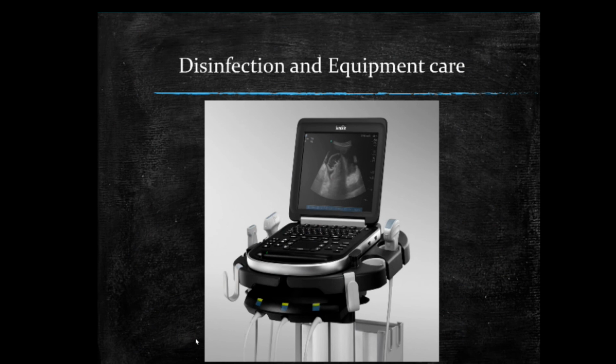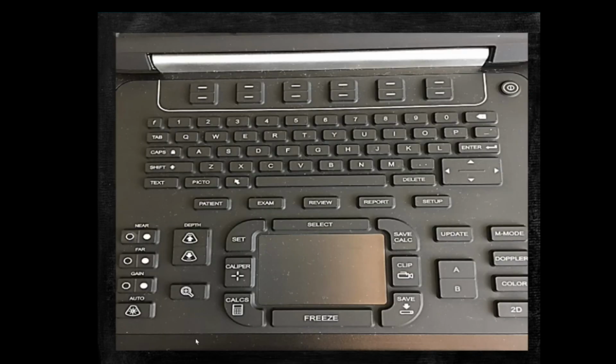Real quick note on disinfection and equipment care. Generally at OHSU, the preferred cleaning solution is the Oxivir TB wipes, but always check with your local infection prevention control department if you have questions about what is fine to use.